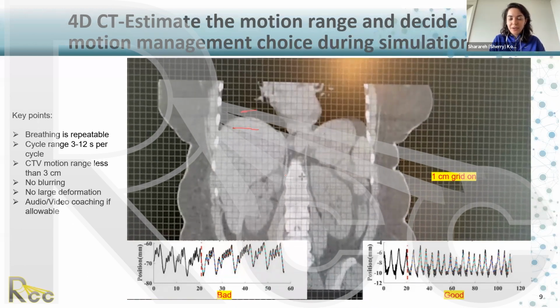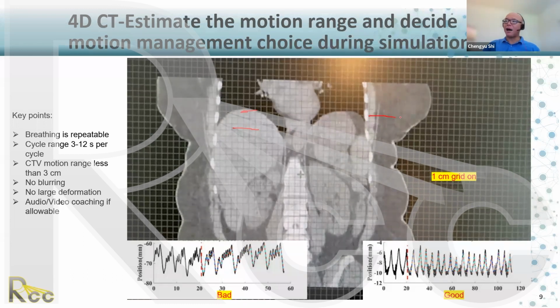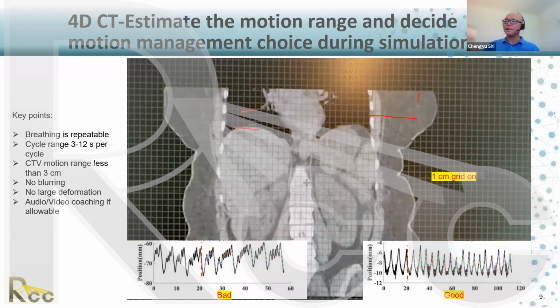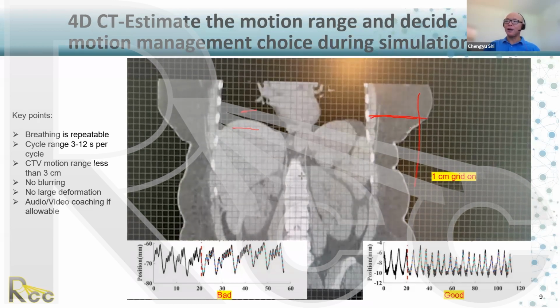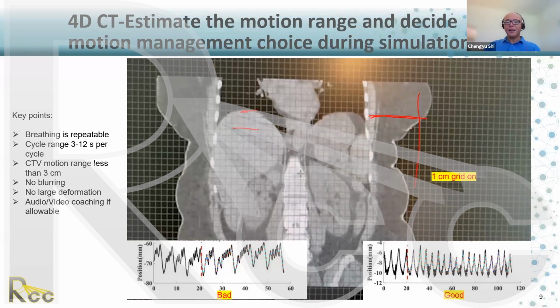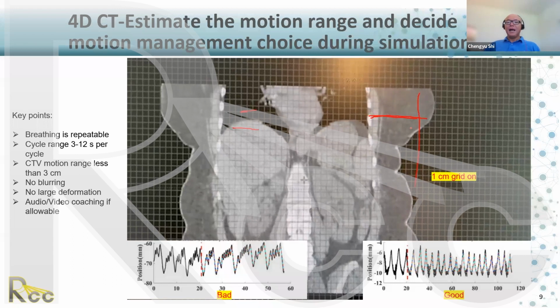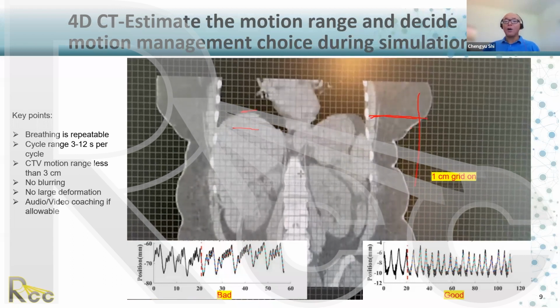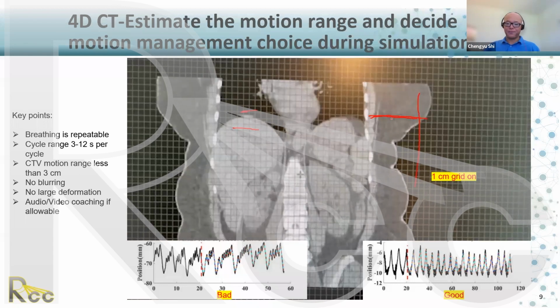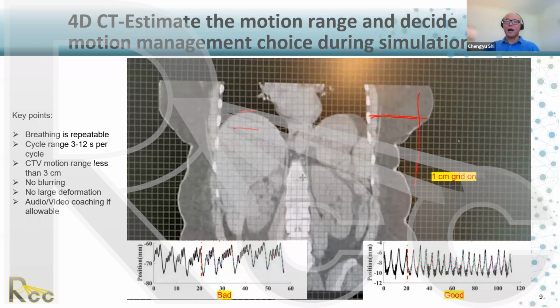Yeah. All right. So you can develop by yourself a perpendicular ruler. There's a longer ruler like this, and there's a sliding ruler. You can slide up and down so that you can put it on the patient's body and ask the patient to breathe in and hold to touch the bottom of the ruler, so that you can record how much the ruler height is.